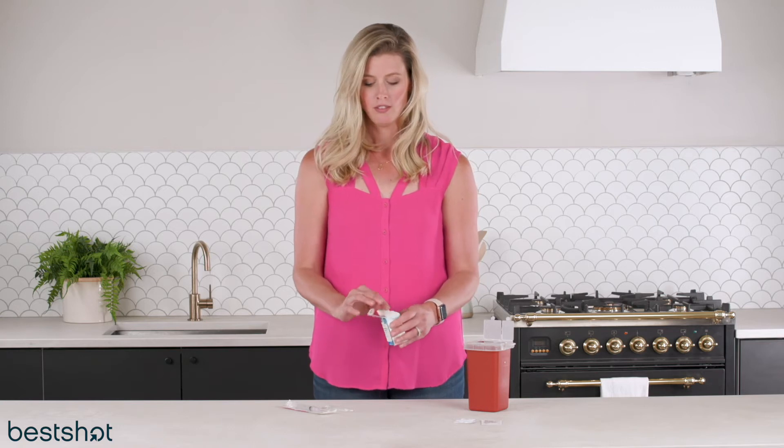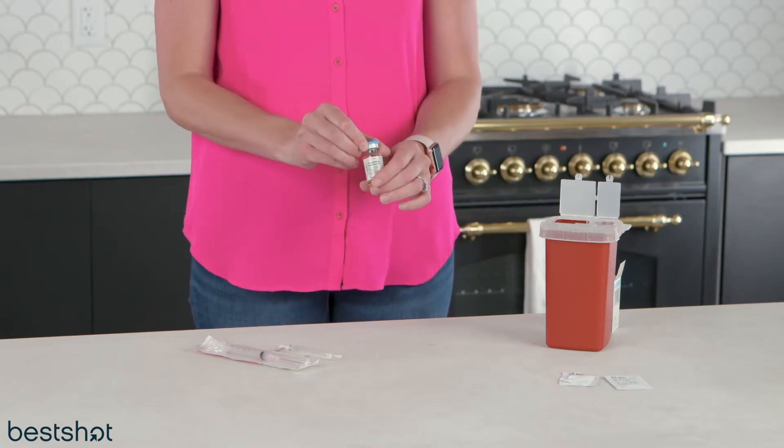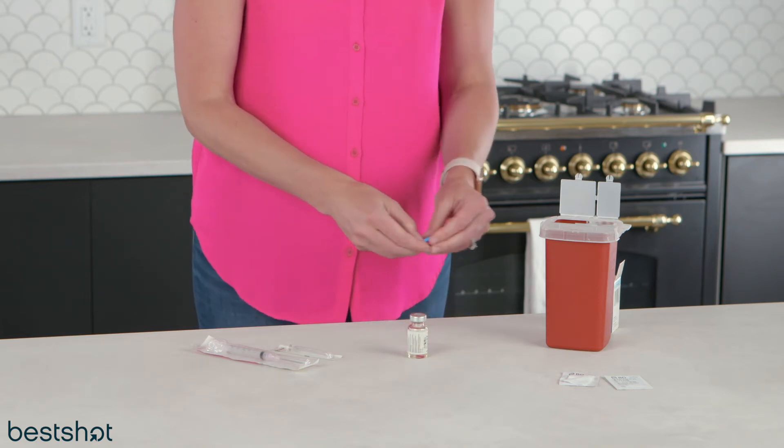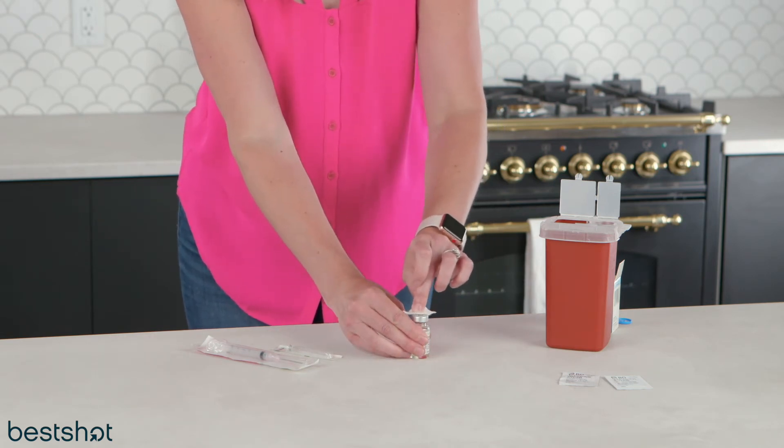The needles get bigger and everyone loves it. The vial looks like this. You're just gonna pop that lid off. You're gonna use your alcohol swab here to clean the rubber stopper, which you're gonna do every time.